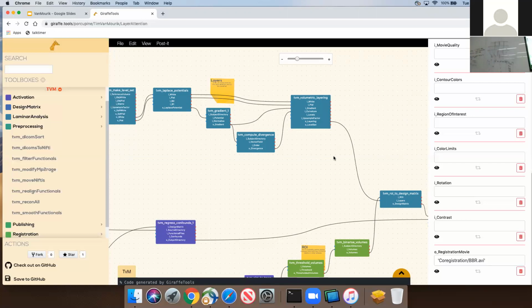Well, yeah. The interesting question you can ask is, all right, how many layers do you need? How many layers would you be able to obtain from this? Because one of the inputs in this method is the number of layers that you want to get out. Whereas if you just interpolate along a line, you can interpolate 3 times, 5 times, 100 times, doesn't matter, right? Whereas if you're actively trying to extract and separate the signals, this needs to be something that you think about beforehand.